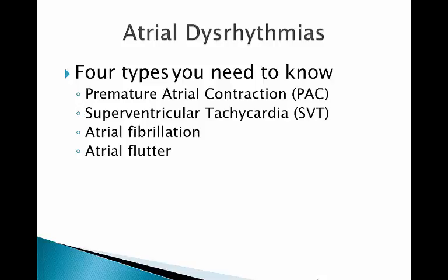This is the podcast for Basic ECG Interpretation Part 3. In this podcast, we're going to talk about atrial dysrhythmias and heart blocks.